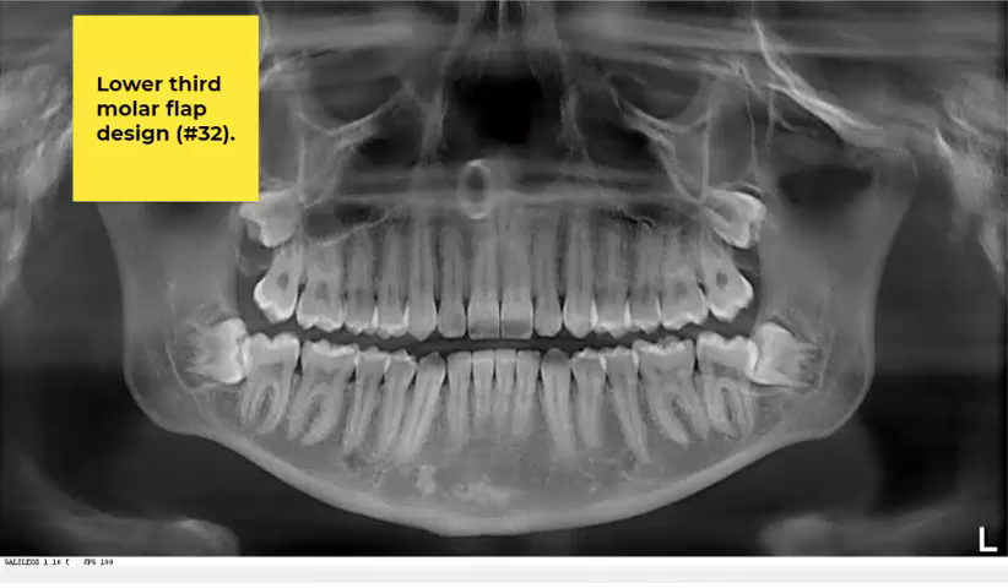This is a panorex from a patient that we removed thirds on a couple of weeks ago, a 17-year-old female. I use this as an example because we were able to do some intraoperative photos over the shoulder with an iPhone — my surgical assistant was able to do that from a distance and made pretty good images — so we could discuss this topic. This is one of the most common questions I get from other dentists and dental colleagues: how I approach lower thirds, or flap design for third molars.